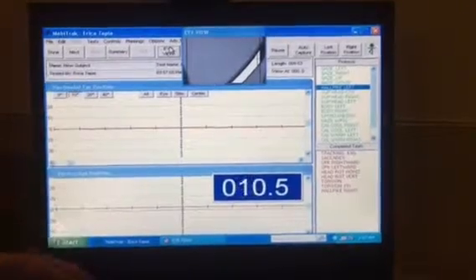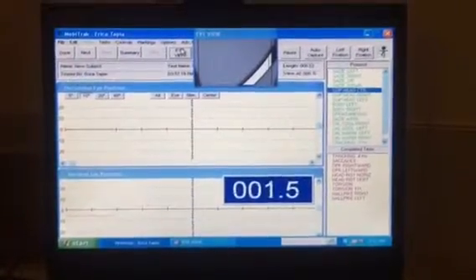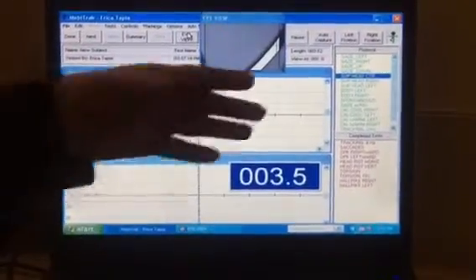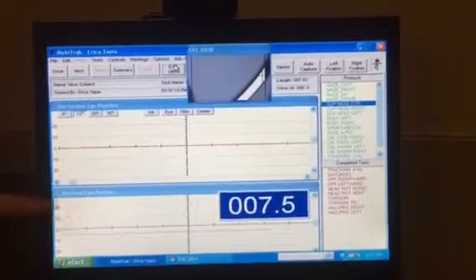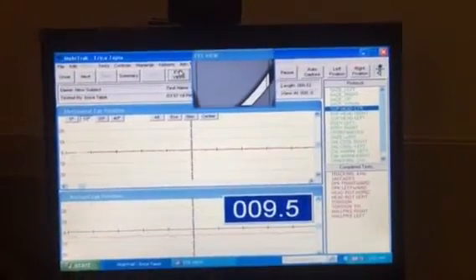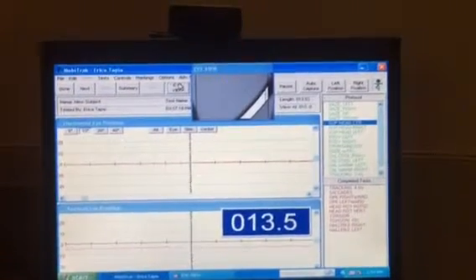And then the head is lower than the shoulder. Then you get rid of the pillow, and they're laying flat. Your test is called supine head center. Supine is 180 degrees. Think of a pine tree is straight. Your patient is straight. The head is looking forward.